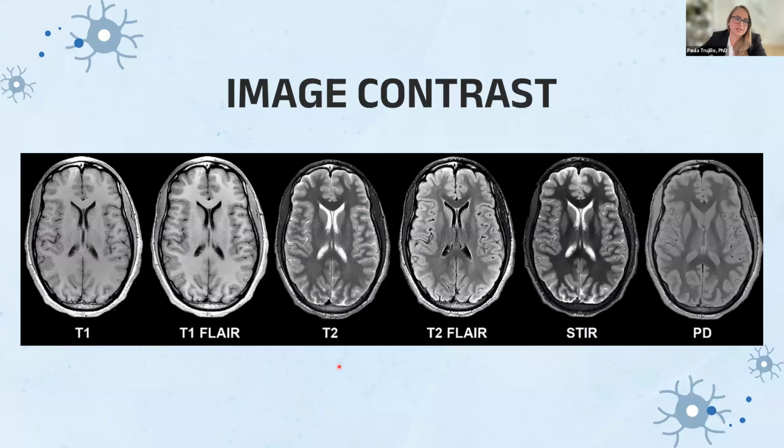Here I'm also showing an example of a T2 weighted image. These images highlight how water molecules move within tissues. So in T2 images, fluid appears bright, while dense tissues like bone appear dark. And these images are useful for detecting abnormalities like inflammation or fluid buildup.